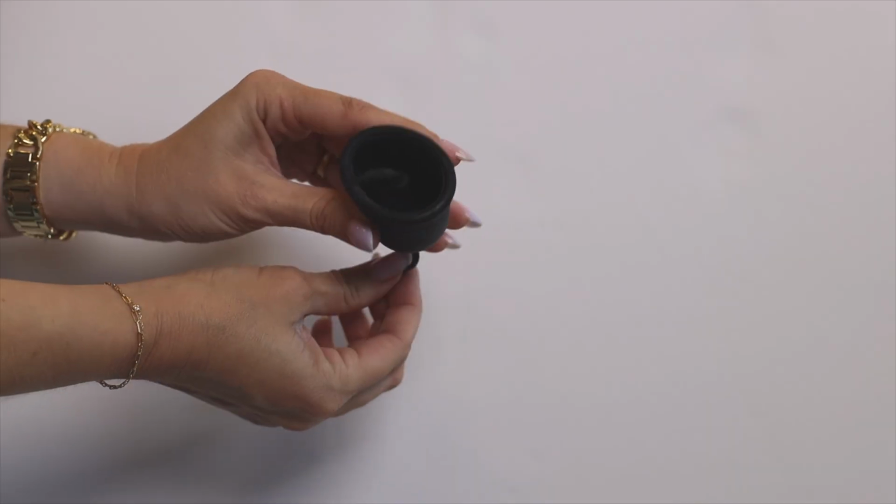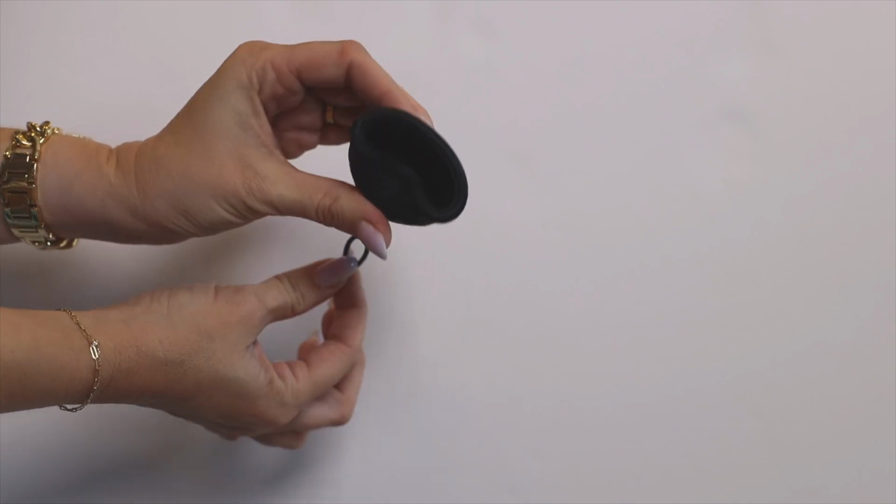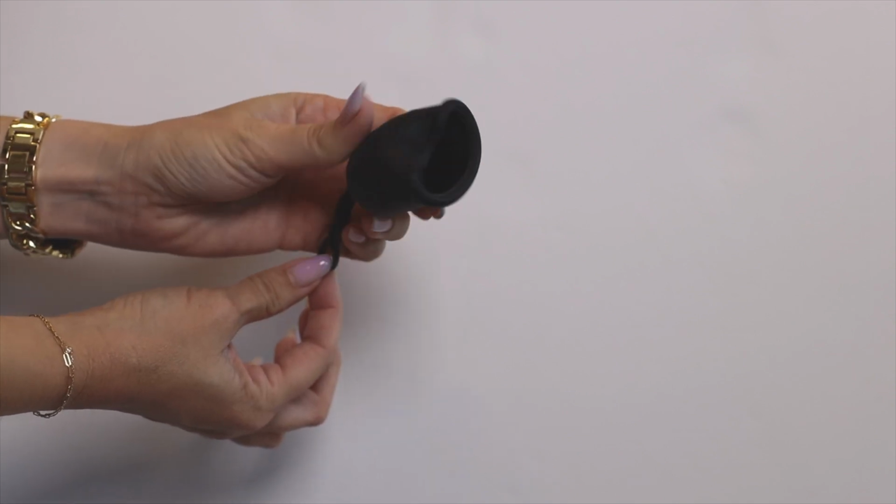There's also the brand Flex, which breaks the seal for you. So if you're looking for something maybe a little easier to remove, that's an option as well. So it's overwhelming, but ultimately, if you do your research, you can find something that's going to work for you.